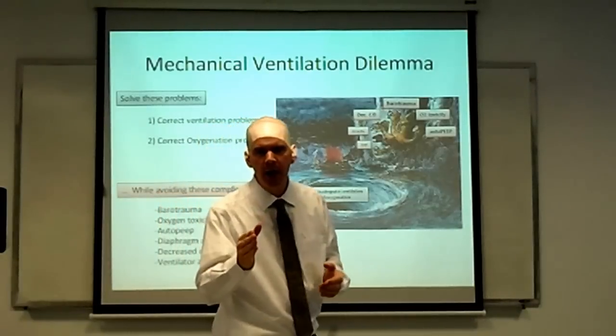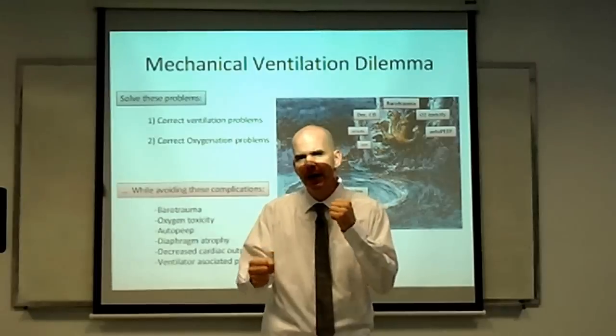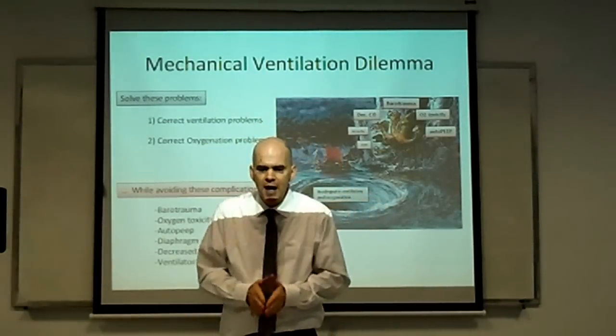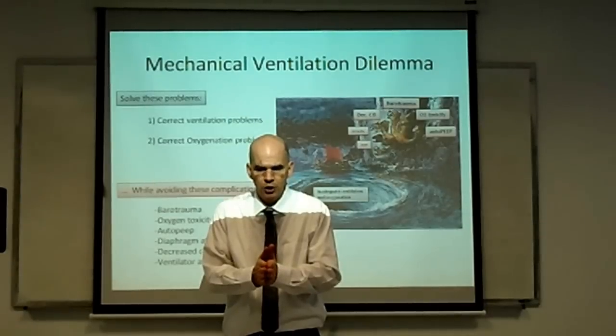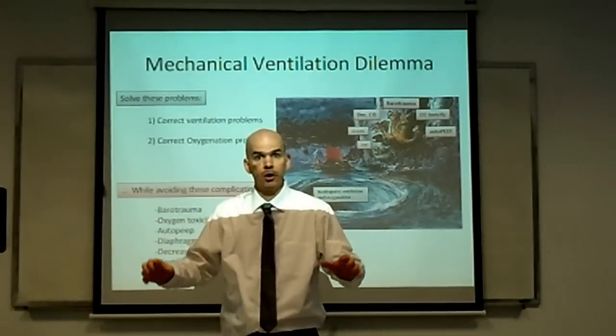What I want to talk about now is the ventilator settings themselves, the various knobs and dials that we can tweak and adjust in order to try to navigate this narrow passage, try to get our patient through alive, trying to avoid the monster on each side.